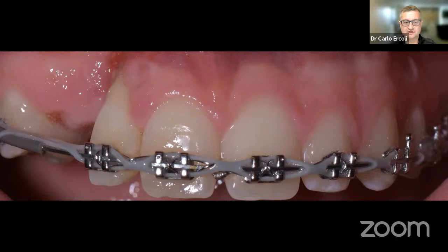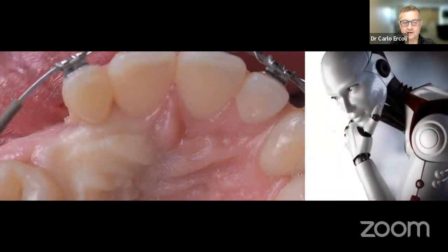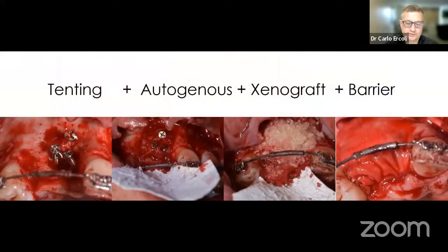This is a case where we have a significant alteration of tooth 12 and 13, with a fair amount of loss of not only soft tissue, but also hard tissue. Again, in this case, and we will perhaps have a chance to touch base another time, we know that we have to rebuild that area after that 12 tooth comes out.